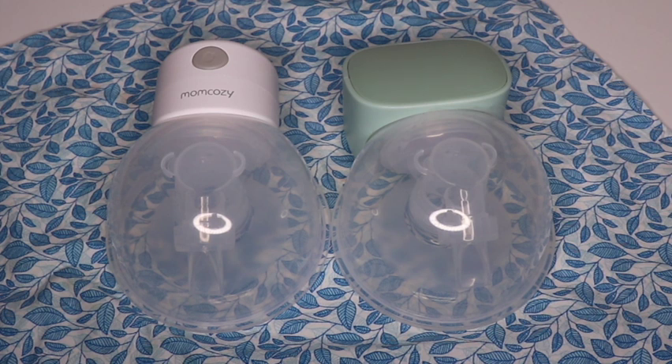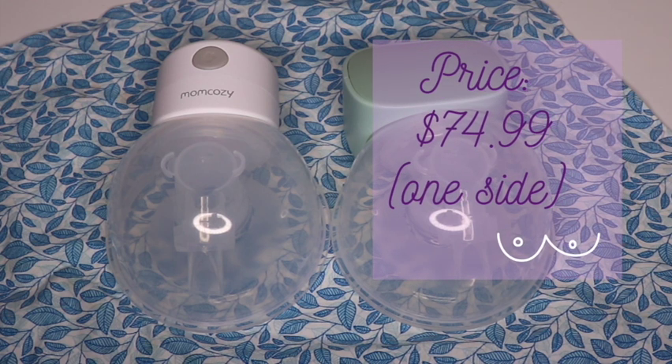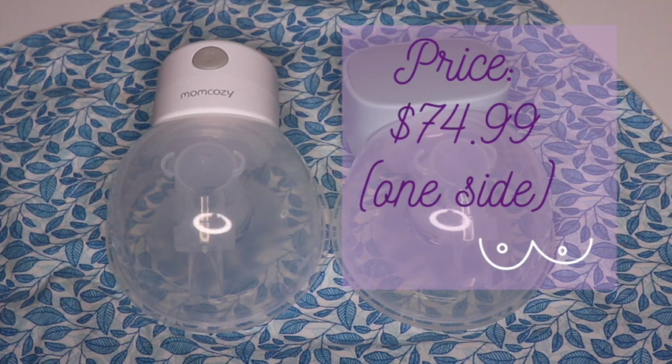I tend to use either one on the opposite breast while my baby is latching. Because she has a hard time latching on the right, I'm mostly exclusively pumping at this point, so it's really helpful to wear this in my bra on the other side — especially in the middle of the night. That's the main use I find for this pump; I wouldn't use it necessarily to establish a supply. Last but not least, the price for a single-sided pump is $74.99 — not bad for an in-bra, portable, wireless, tubeless, cordless pump.